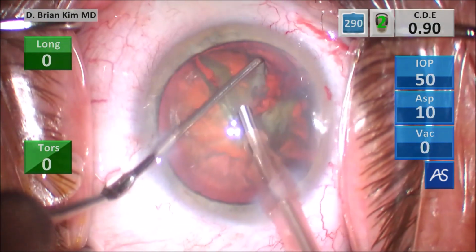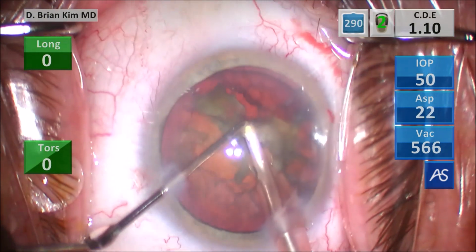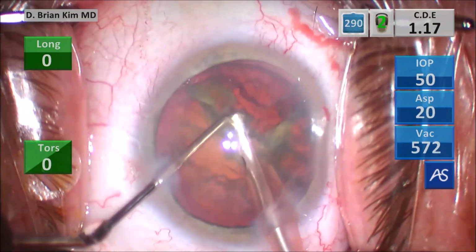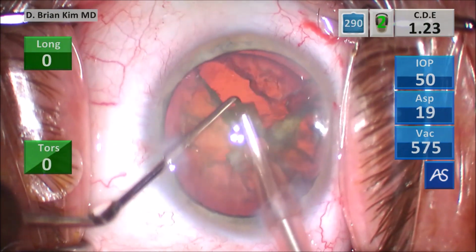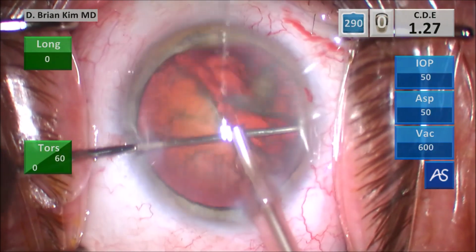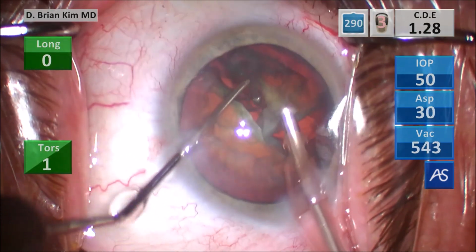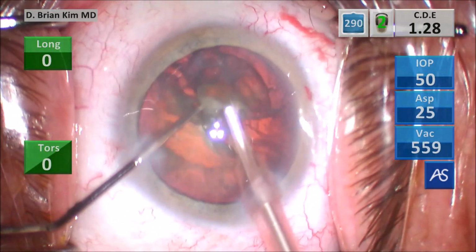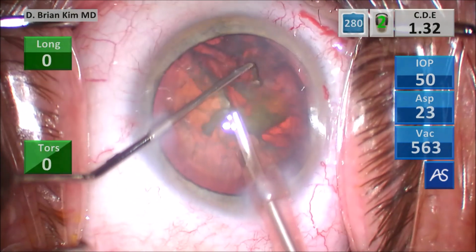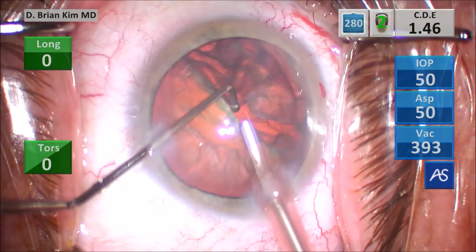It's easy to do. And if you know what you're doing, you really never struggle or worry about being able to get lens pieces out. You can do it very efficiently. And again, you're utilizing less ultrasonic energy as well as less vacuum to do it this way. So again, I'm using crushing forces. I used another cross-chop maneuver to crush and bisect that second quadrant. And then I'm using crushing forces to break up that remainder of the pieces of the second quadrant.